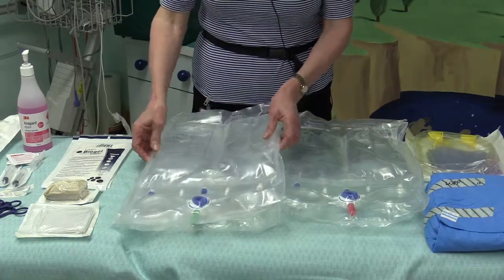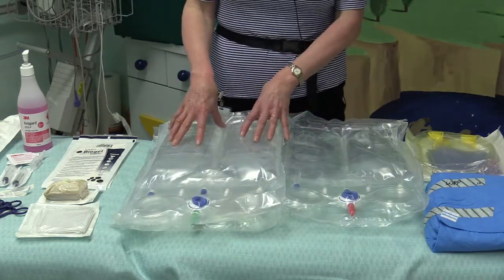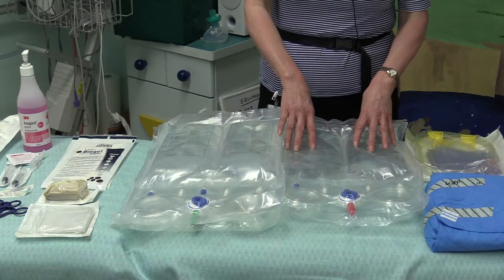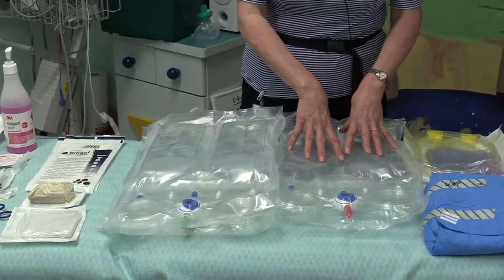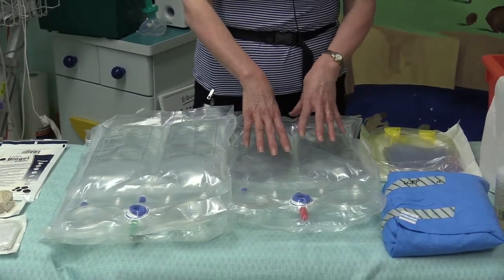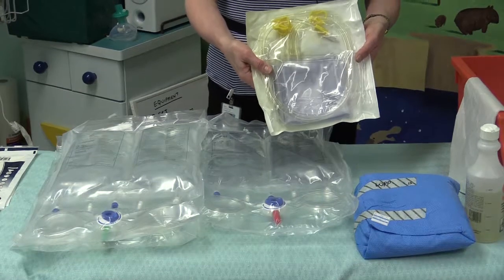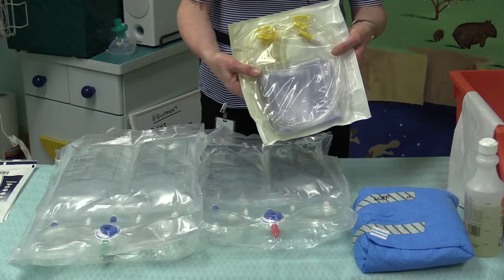We have 2.3% glucose, which is green, so a moderate amount of fluid will be removed with the 2.3%. Then we have 4.25% glucose, which is coloured red, and we won't actually use that initially. That's only to be used if the child's very fluid overloaded and we're not achieving adequate fluid removal. We have a sterile drain bag which will be used to collect the ultrafiltration fluid.